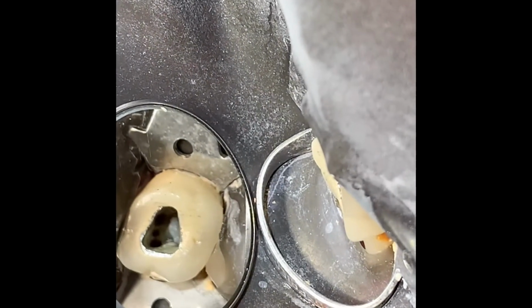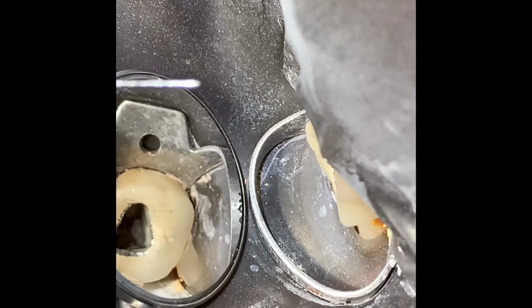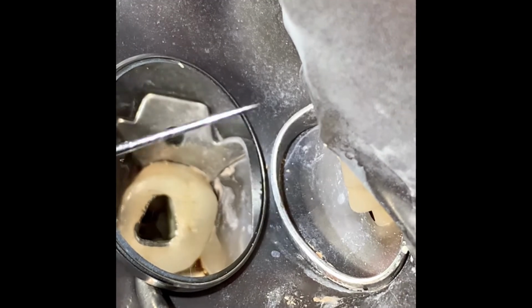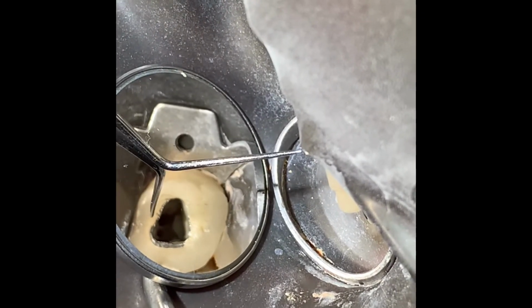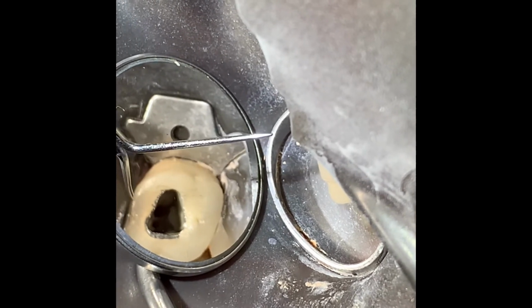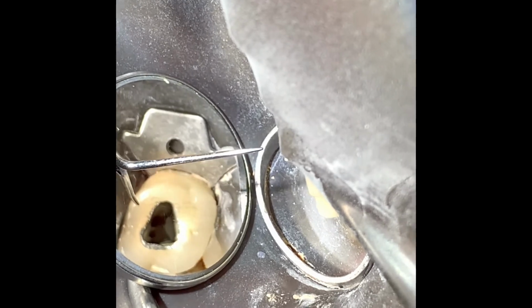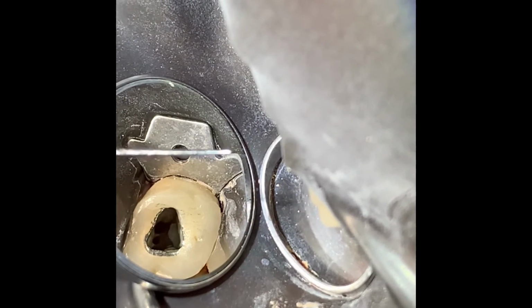Yeah, so I'm not sure if you remember, guys, this wonderful patient of ours that we're gonna cover, of course, her face is not going to be showing on the video. She came to me. An endodontist had done this root canal for her, and I think I discussed that, an endodontist in the Bay Area, a lady endodontist. And today we opened the tooth up.